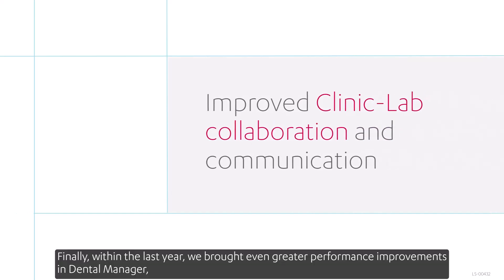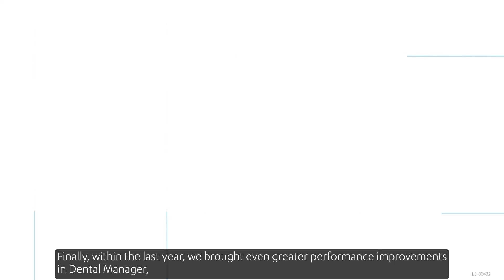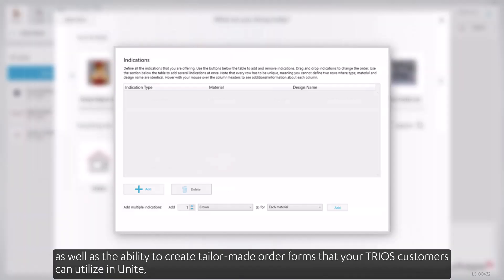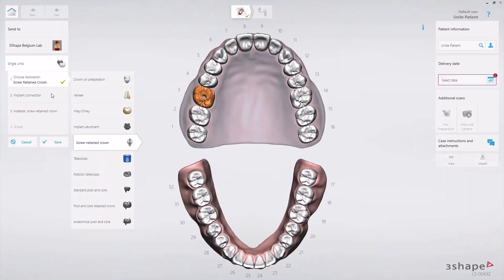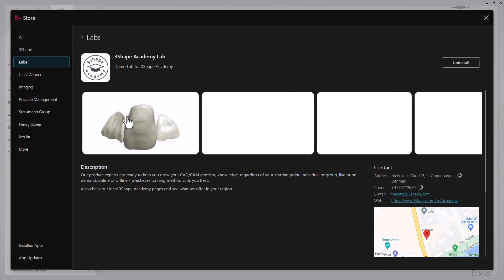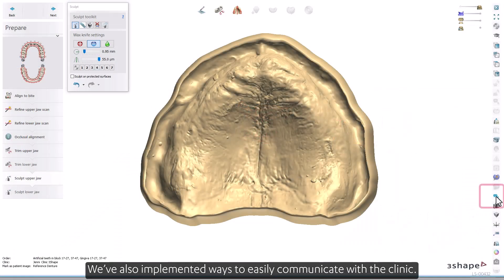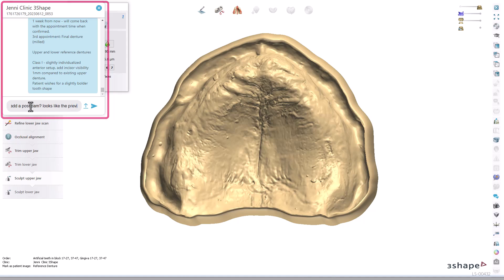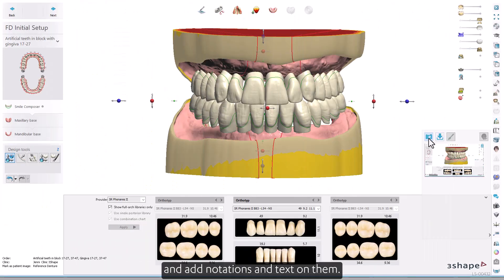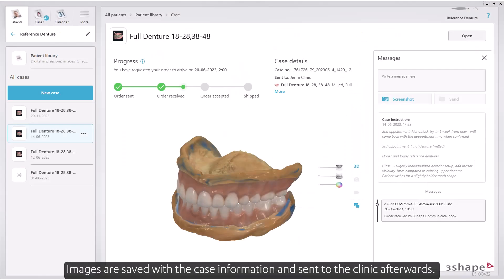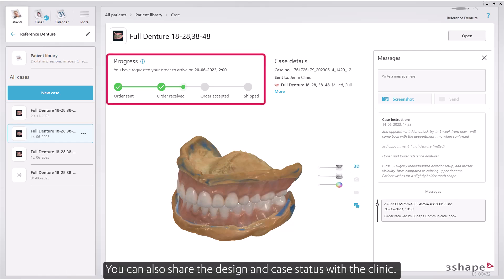Within the last year, we brought even greater performance improvements in Dental Manager, as well as the ability to create tailor-made order forms that your TRIOS customers can utilize. We've also implemented ways to easily communicate with the clinic — an integrated clinic-lab chat is available at any design step, as well as 3Shape Communicate. You can take screenshots of your design, add notations and text, save images with the case information, and share the design and case status with the clinic.